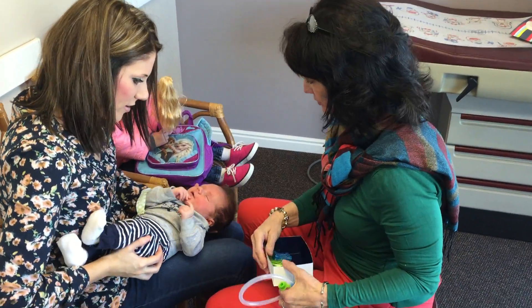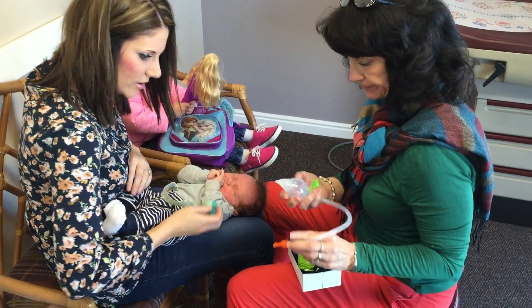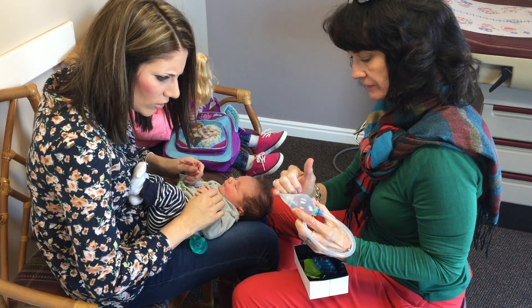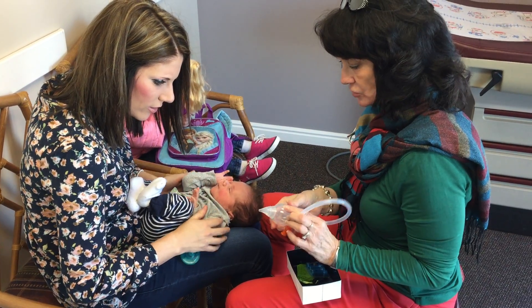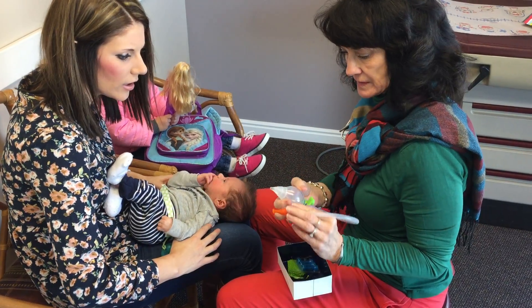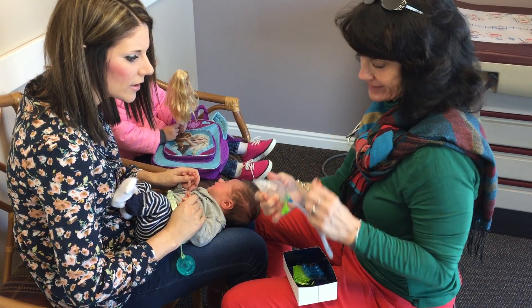So, Mrs. Bill, to help with Cooper's stuffy nose, I'm going to show you how to use the NeilMed aspirator. It's got this really nice little soft tip. You know how you've squeezed and tried to get the suction out their noses? This is really nice because now you control it with your mouth, and you just suck it out.